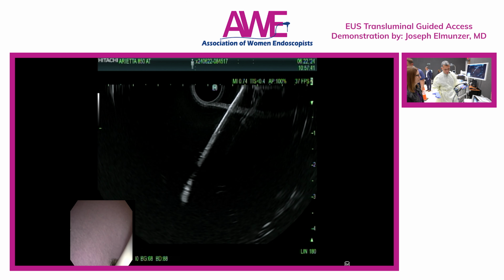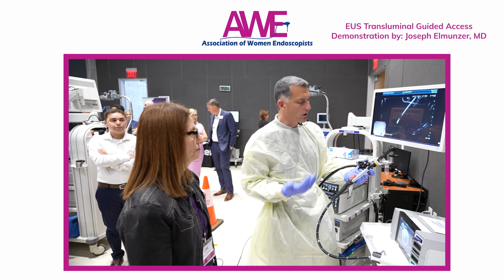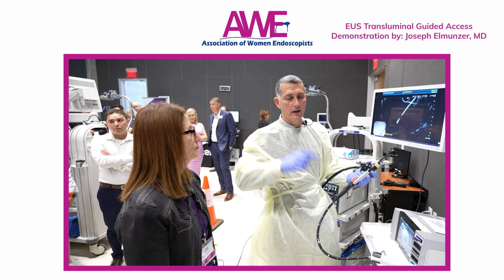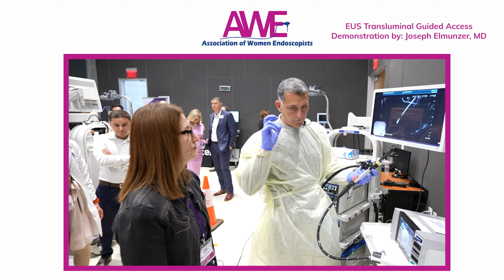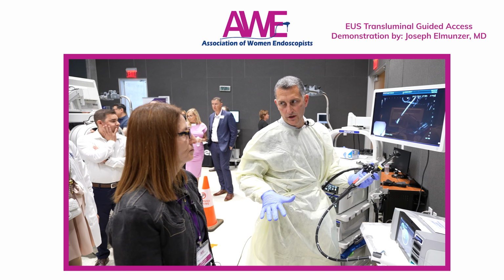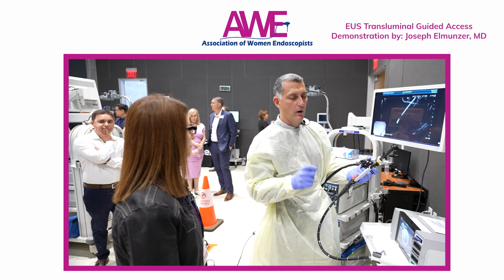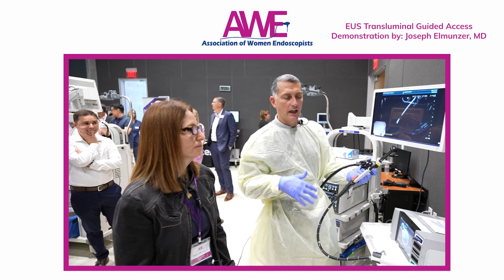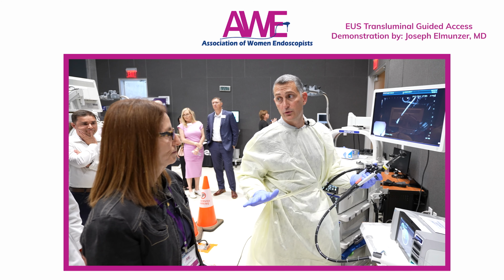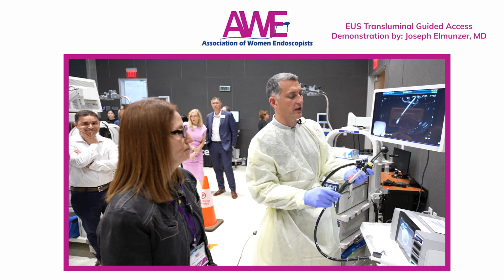So one question that comes up, Mary Lee, is whether you need this preloaded with a wire. A couple things I'll say about that, and we learned this the hard way: the commitment to always having a wire and pushing it into the target structure for safety reasons turns out not to be the best for every single situation, particularly if the working space is small or it's very mobile. With the wire, sometimes you can push yourself out. And so, for example, in my practice for EUS-guided gastrojejunostomy, I typically don't preload with a wire, but in some cases it's helpful.